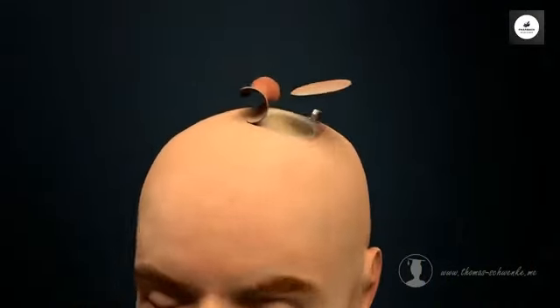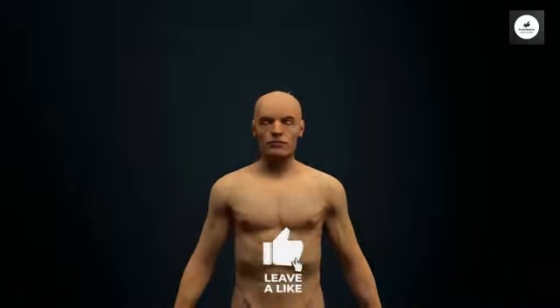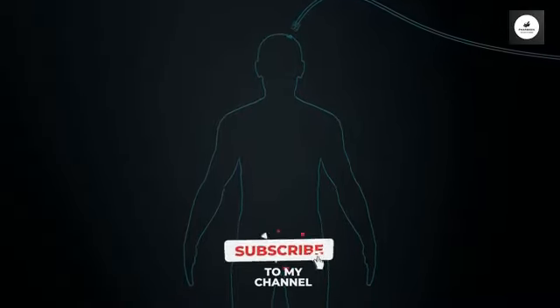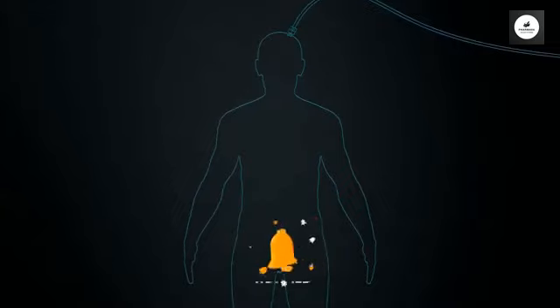An external device can then be connected to the implant. This allows currents to be generated, which then stimulate the relevant area of the brain. This ultimately leads to movement of the body part.